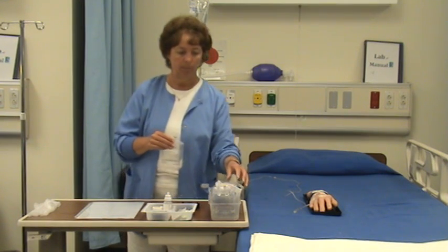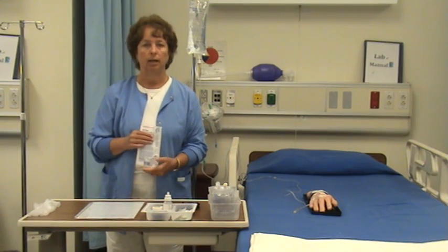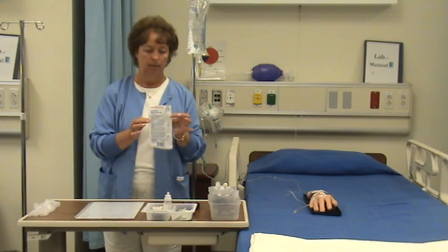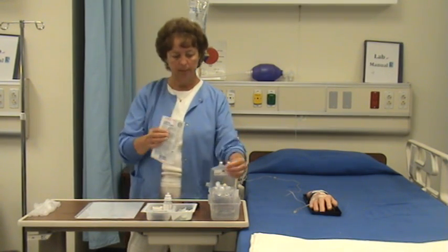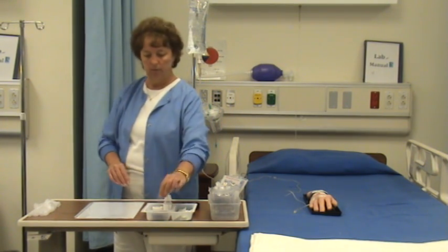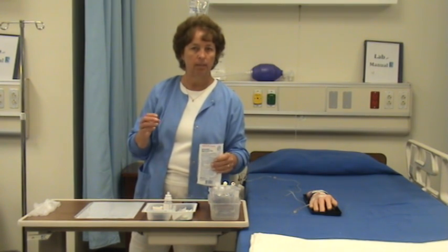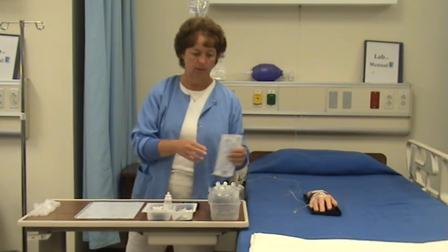Because it's going into a primary IV site, IV line, it's actually considered a secondary IV bag. So what I need to also get is a secondary IV medication tubing. So I've got my antibiotic, I've got my tubing, I've got my MAR, and now what I'm going to do is grab an alcohol swab, which I will need, and prepare my IV piggyback medication. I can do this in the medication room or in the patient's room. Usually you do it in the medication room and then bring it to the patient.